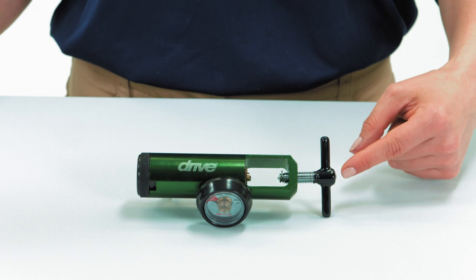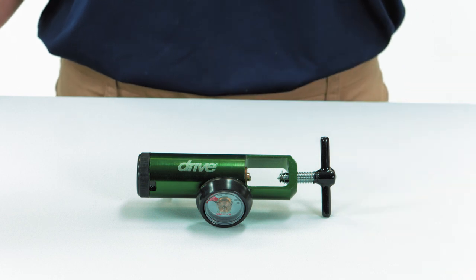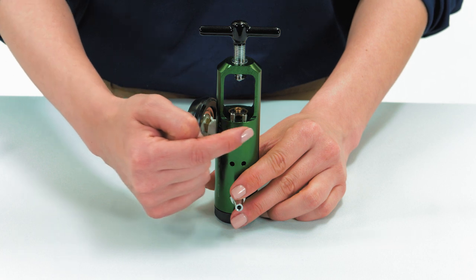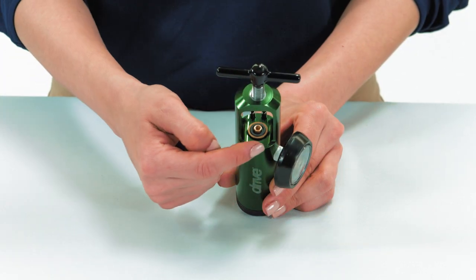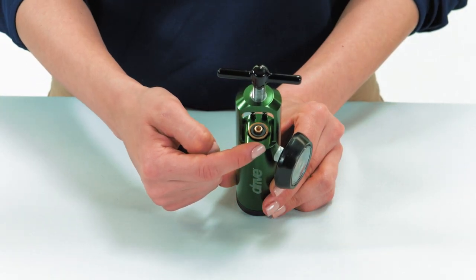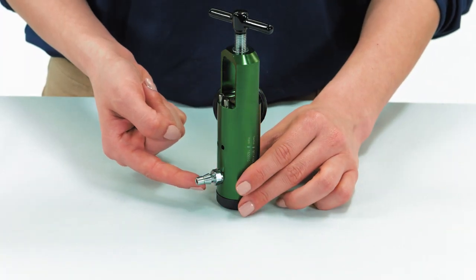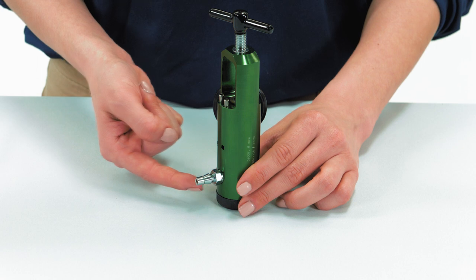The T-handle is used to tighten the regulator onto the cylinder. The alignment pins help properly mount the regulator onto the cylinder. The seal washer minimizes leaks between the regulator and the cylinder. The hose barb connects to your oxygen cannula so you may receive the prescribed amount of oxygen.